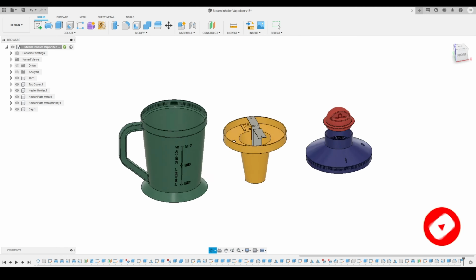So this will act as a 1 millimeter, 2 millimeter thick vase. So here you can see two bodies we got. This is body 1 and this is body 2, since we had revolved both the bodies as separate bodies. Now I will go on to create a sketch tool. I will activate the create a sketch tool. We'll select this front plane as a sketch plane, and here you can see my sketch tools are active.